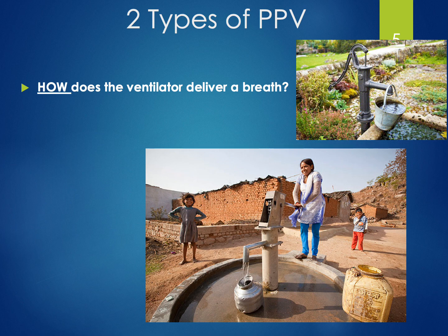Now, depending on how hard you push on that lever, you'll get different amounts of water. Let's say pushing with all of your might is 10 out of 10. And then just barely pushing down on the lever with your hand is a 1 out of 10. Now, the point of pushing down on the pump is to get water into your bucket or a volume of water. So if someone said, push as hard as you can, you will do just that. You'll push it a 10 out of 10, and you'll probably get a big amount of water on the other end of the pump. But that's not really what you were told to do. You were just told to push really hard.